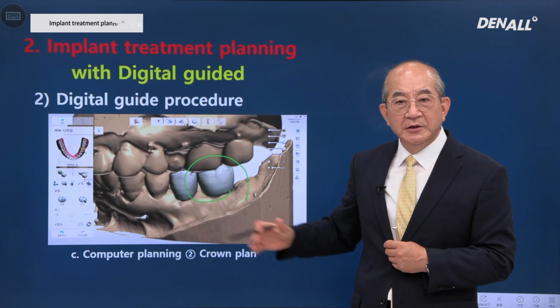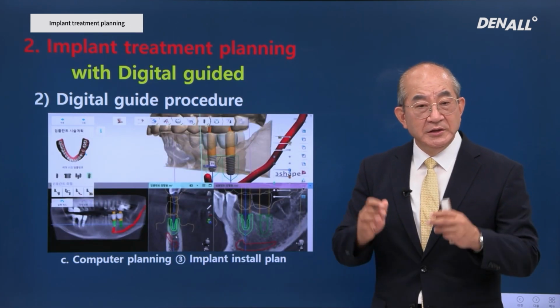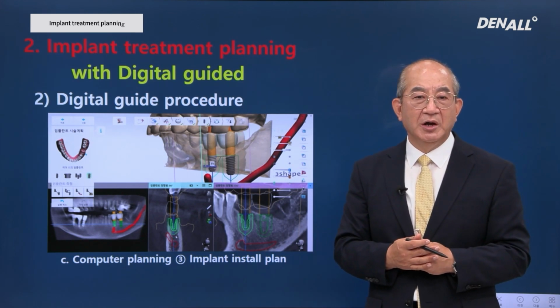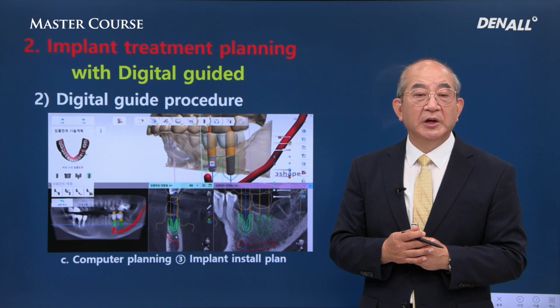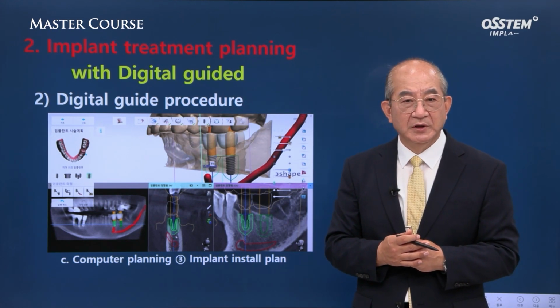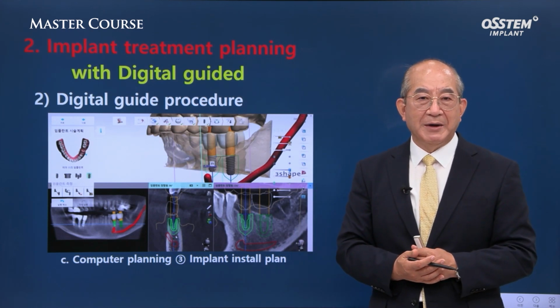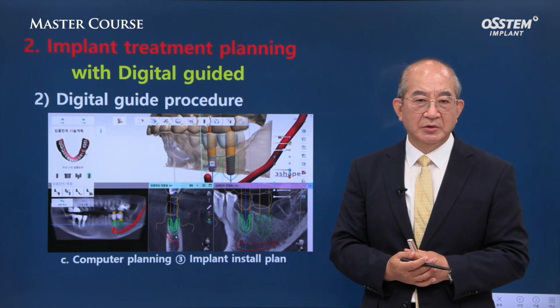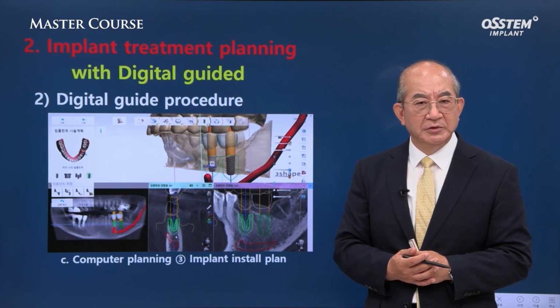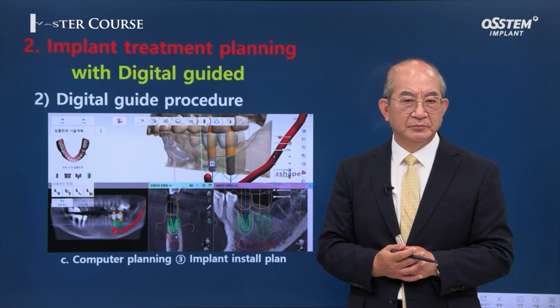What is important about CT data is that you can get a good sense of the important anatomical structures, which were not clear in the panoramic images. Unlike the past, many dental clinics are subject to medical disputes, and the highest percentage among the disputes surround implant treatment. There are many reasons for that. What is most important in medical dispute are three factors.